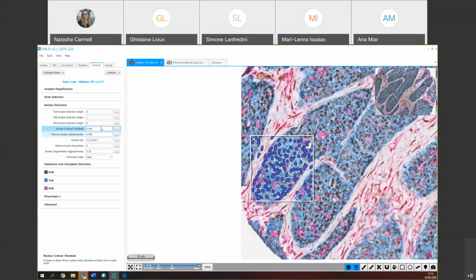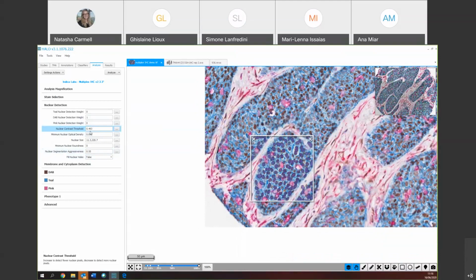All right. One thing I like to do is to go under the toggle analysis tool here and set the transparency higher, just so I can see my nuclei under the markup and see if what I'm doing is all right. And think about this parameter not as a linear step-by-step thing, but rather as a compromise. All these parameters will work together towards an optimal segmentation. So make sure that you go back and forth between them, just to see if this is working or not. Even if your parameters are not set in the optimal way at the beginning, it's not a problem, because you can always go back and forth and see what's the best fit.